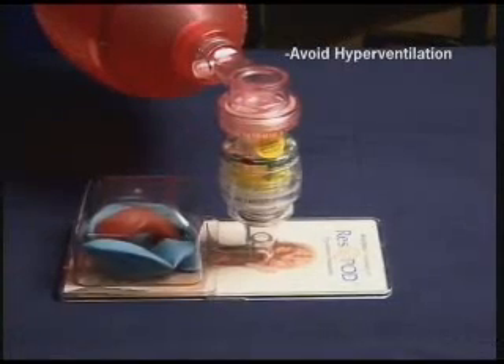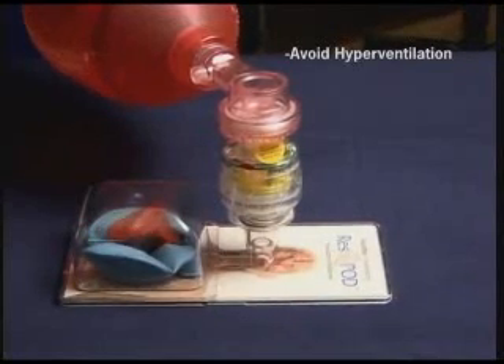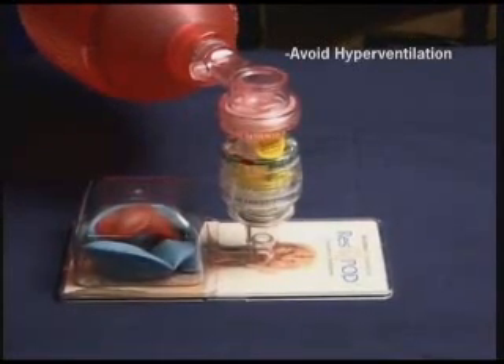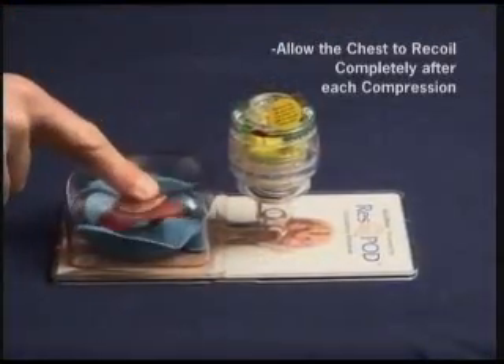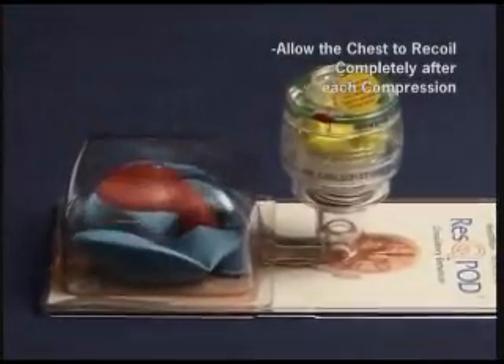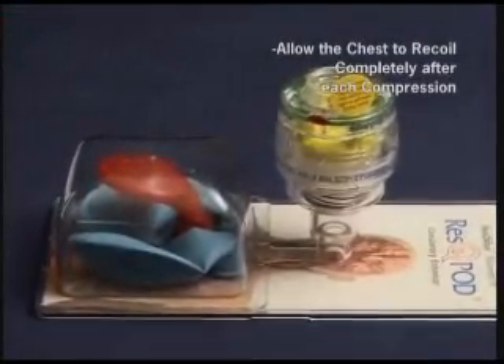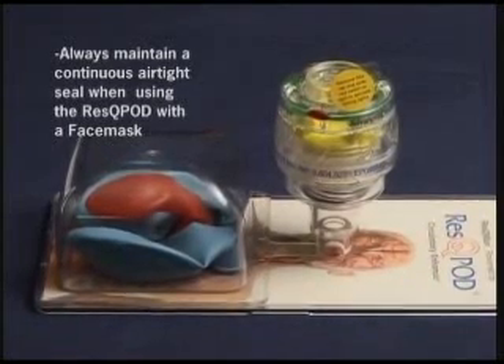Excessive ventilation with mouth-to-mouth or a resuscitator bag actually inhibits blood flow back to the heart, and you can see the heart shrivel up with each compression. It's important to allow the chest to fully recoil each time, or you won't optimize the benefits of CPR. And finally, remember to avoid leaks around the face mask to optimize the benefits of the impedance threshold device.